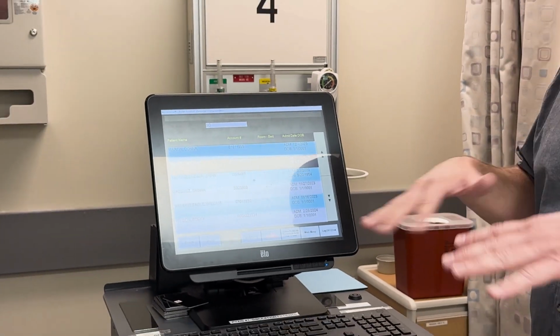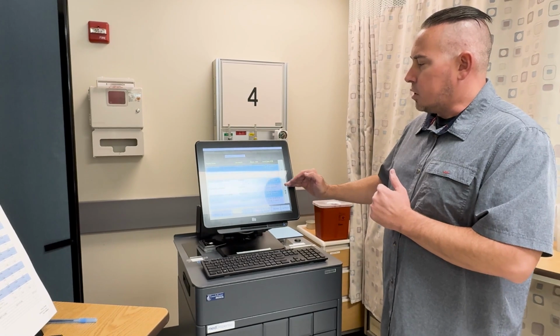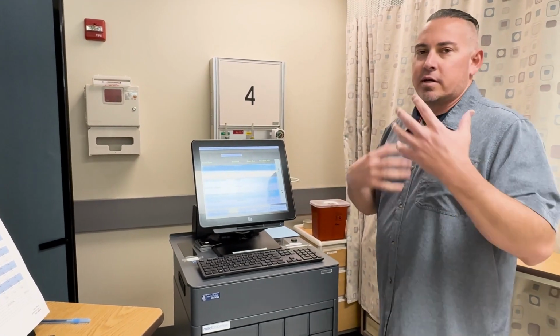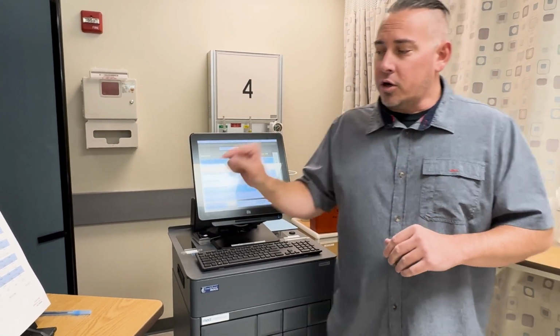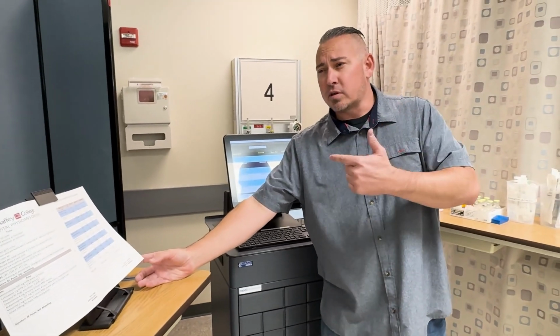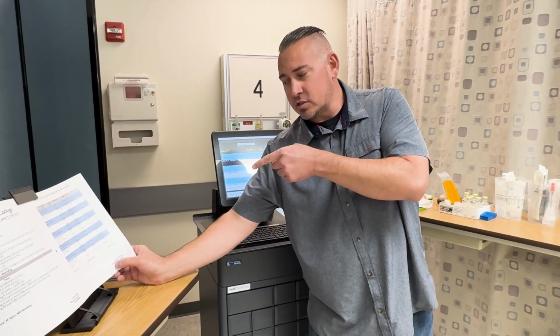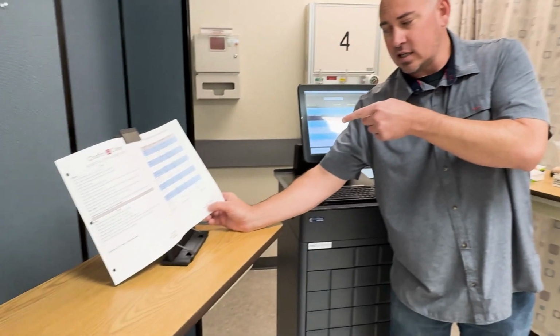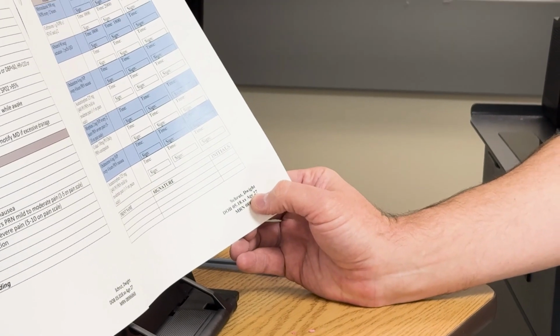What you might get confused on is you might see the admission date and his birthday. Those are going to constantly be changing. Don't worry if the birthday appears wrong or the admission date appears wrong. That's something from the internal side that we have to fix. Don't worry. On all patients, because we don't want to have to update these patients' birthdays every year, we made them all like this. So you'll see his birthday is 5/18XX, and his age is 27.